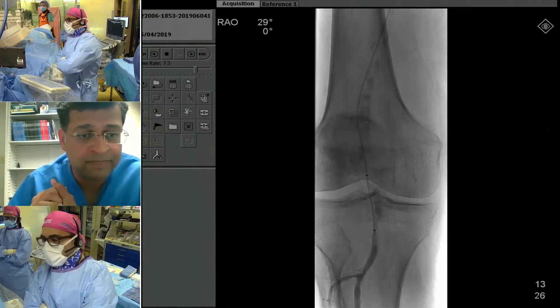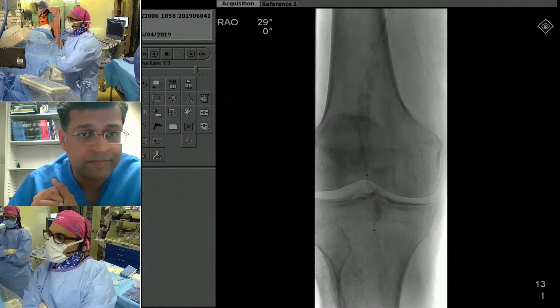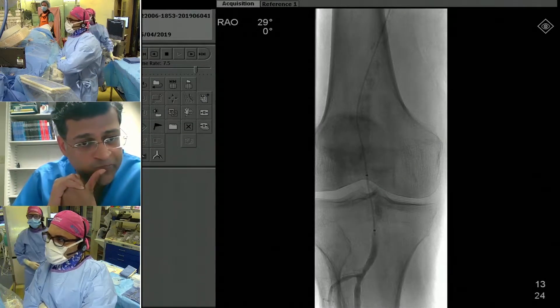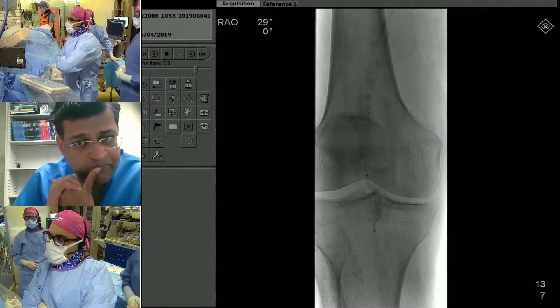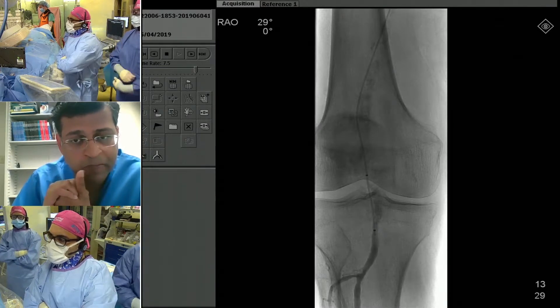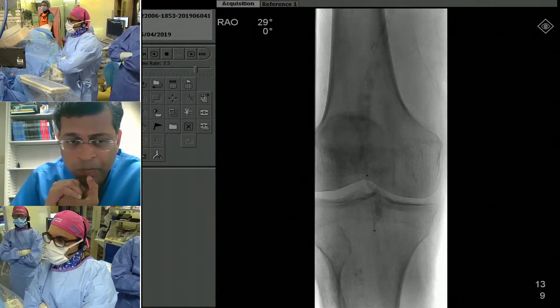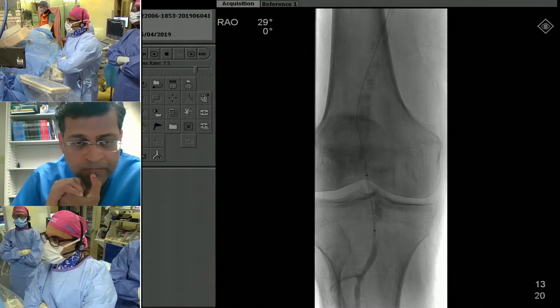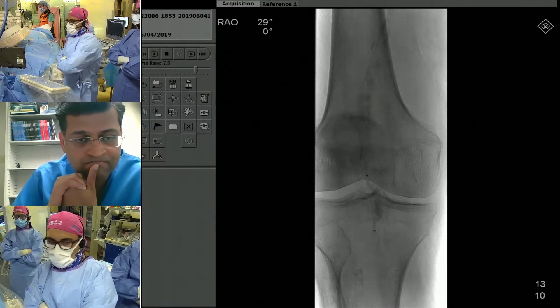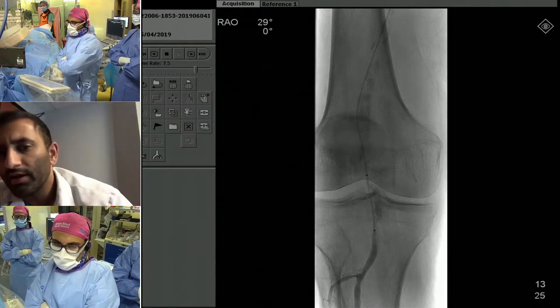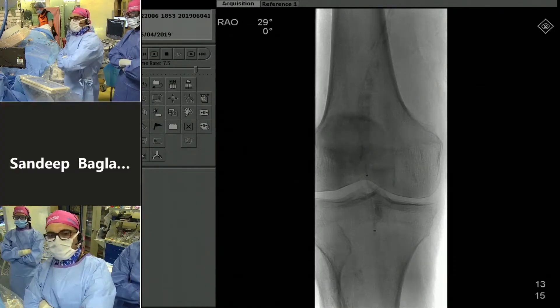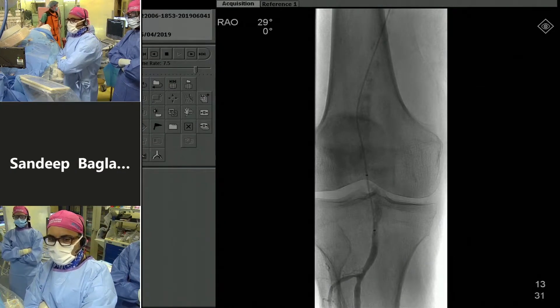Now we have the tools to do orbital atherectomy from the radial approach using the 200-centimeter CSI. I don't think there's any other atherectomy device long enough to get to the popliteal from the radial approach. Now, the proximal lesion is more of a uniform lesion, but the distal lesion is more like a cauliflower-type plaque. That's a concern — I worry about bulky calcification and embolization with CSI.